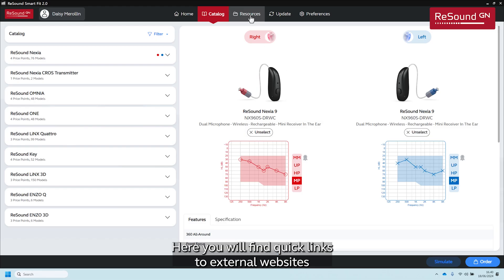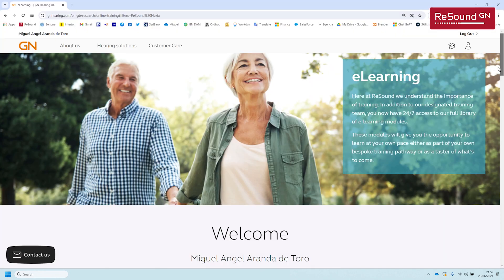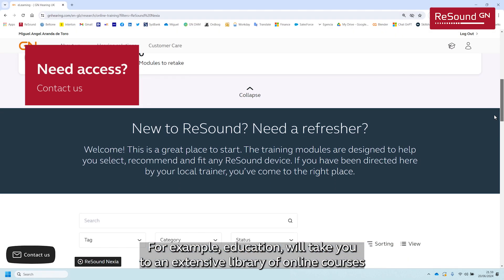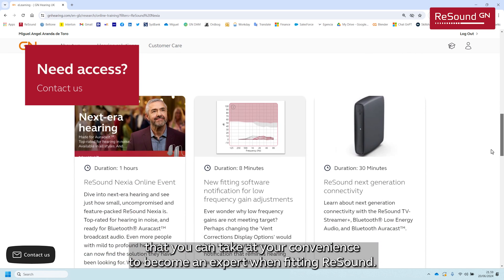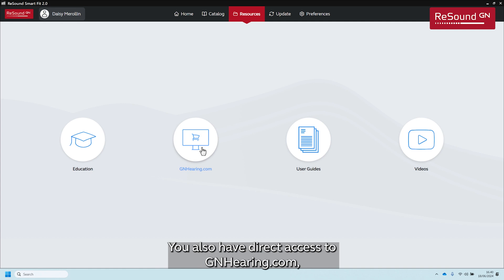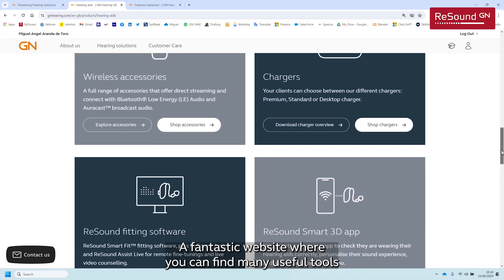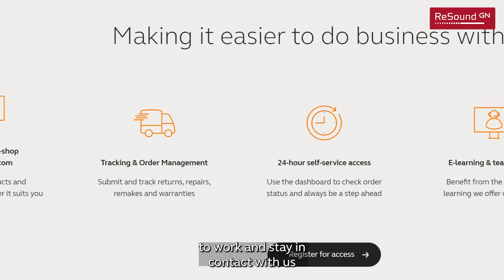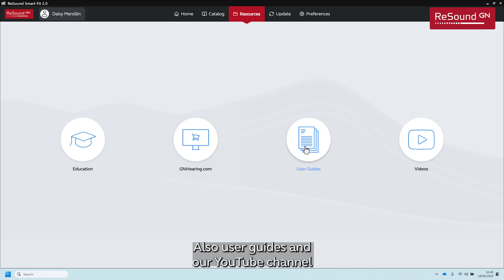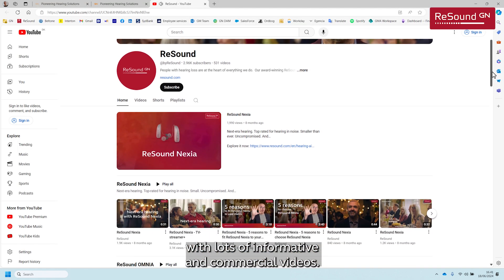Here you will find quick links to external websites where you can learn more about products and services. For example, Education will take you to an extensive library of online courses you can take at your convenience to become an expert when fitting ReSound. You also have direct access to gnhearing.com, a fantastic website with many useful tools, plus user guides and our YouTube channel with lots of informative and commercial videos.